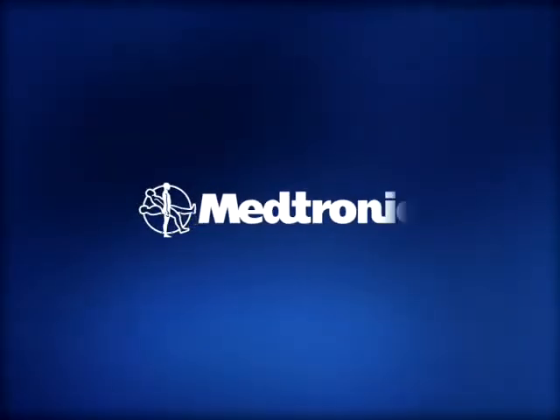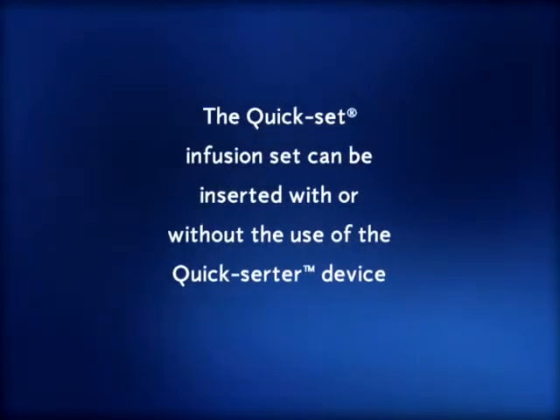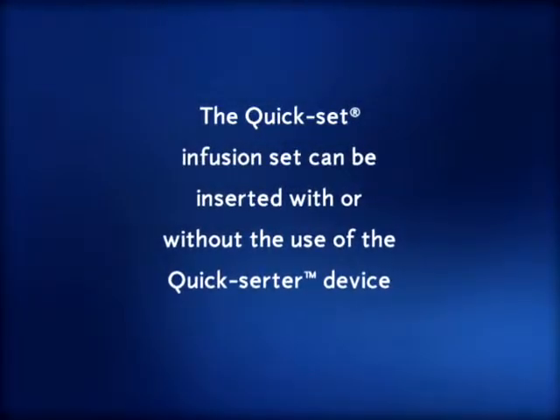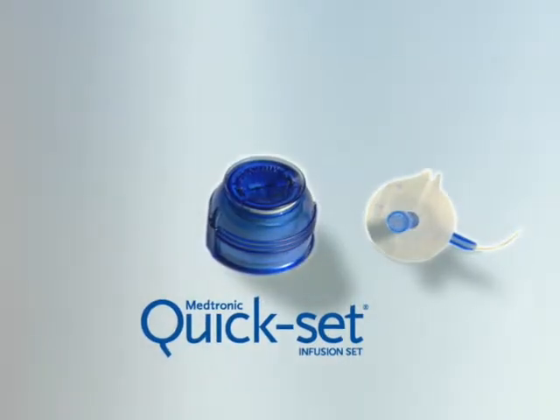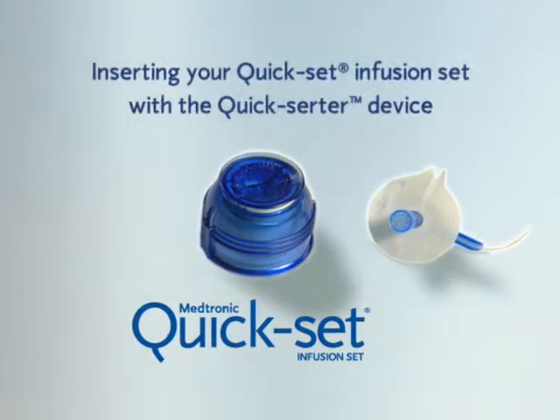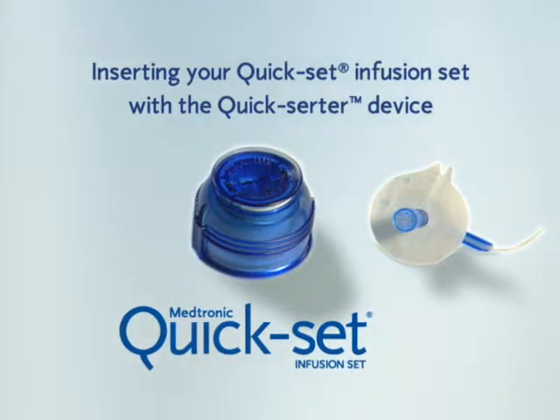This video is brought to you by Medtronic Diabetes. The Quick-set infusion set can be inserted with or without the use of the Quick-serter device. The purpose of this video is to demonstrate how to insert your Quick-set infusion set with the Quick-serter device.